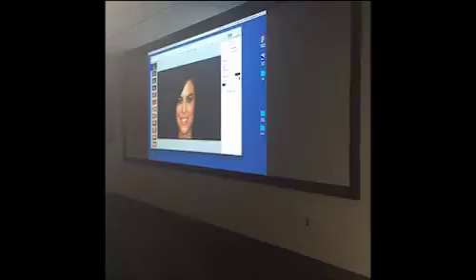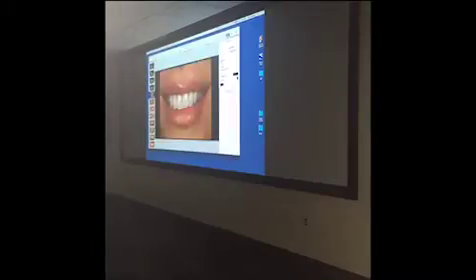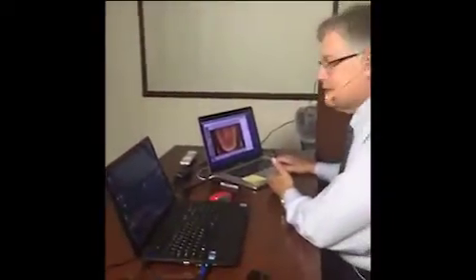You guys have them on a disk, but if you ever want them not on the disk, you just email me and I'll connect you with a Dropbox link that has all this stuff in it. I want you to notice that this one has been created with 18 images in it. And those are the 18 images that we recommended that you take as a full series of imaging on a patient. You'll notice, as I said, I store all mine upside down, so these are upside down.